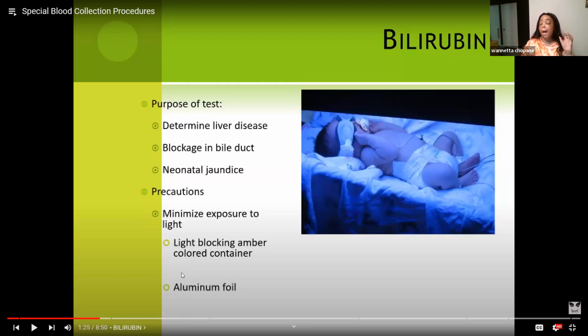Therefore, the biohazard bags I showed you this weekend are clear, see-through, with that little red box for the biohazard sign. But this particular blood has to be put in a bag that is an amber pink color.